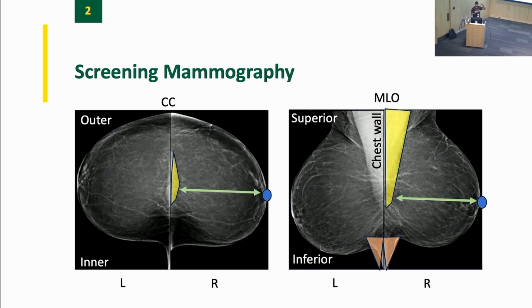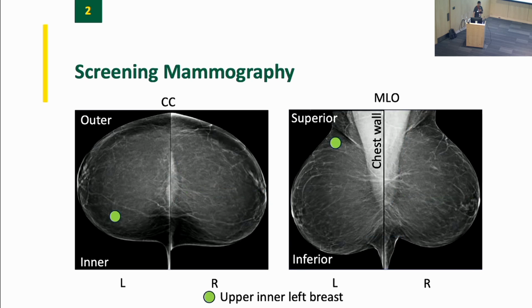So when we get into the data set for a given exam, you might see 2 left MLOs or even 3 left MLOs. And the reason for that is that the first one or the second one did not meet the quality criteria for the image. And Beatrice will talk about how to handle that tomorrow. Okay, cool. So let's do a little practice.